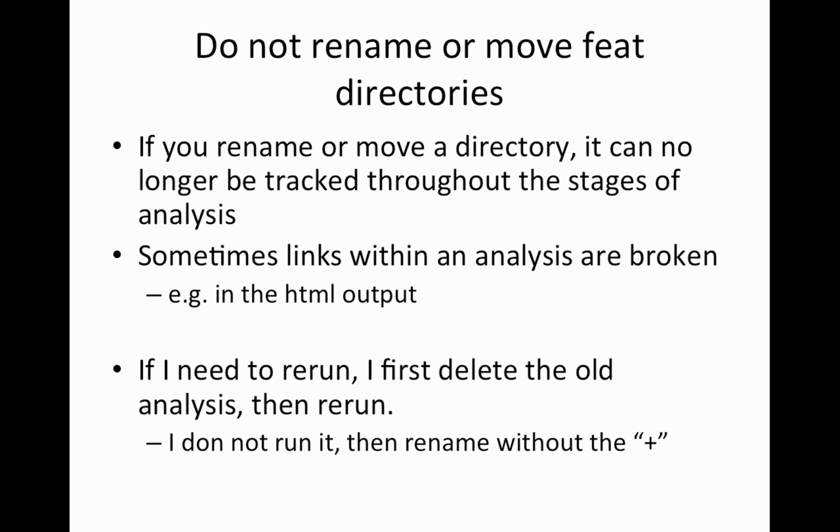I highly recommend you do not rename or move your feat directories. I especially stress do not move your feat directories or rename them. Okay, both of them. I'll explain why. One of the beauties of this, SPM's similar. If you look at the spm.mat, you can kind of trace your way back to the previous stages of the analysis. FSL, you can do the same thing.